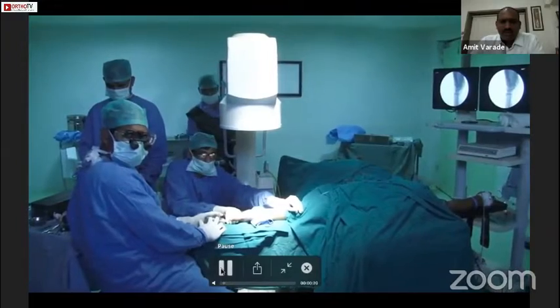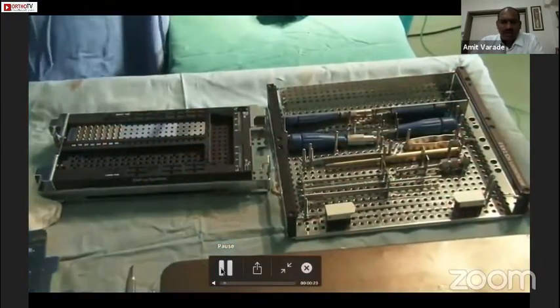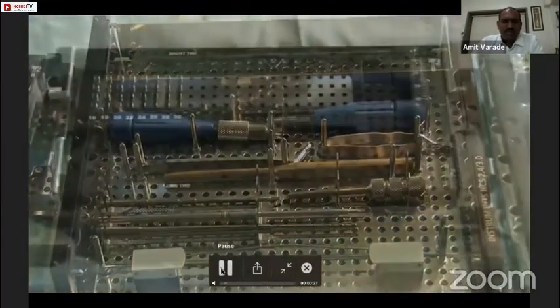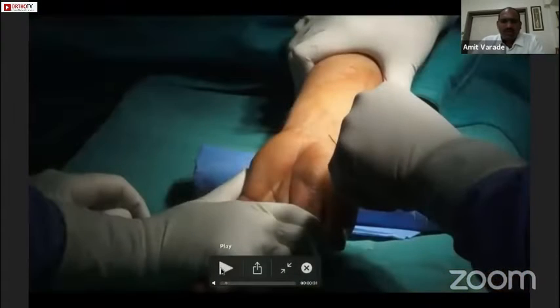Next, we have to extend the wrist and deviate it on the ulnar side. Before doing any surgical procedure, we should very well know what instruments are available for the surgery and check whether we have all the screw sizes available or not.